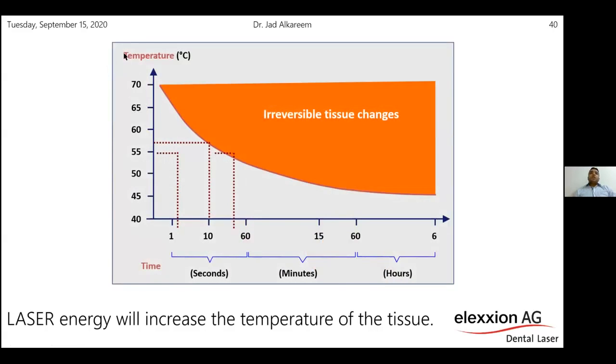This slide shows you the temperature and the time that will cause the laser to increase the temperature of the tissue.